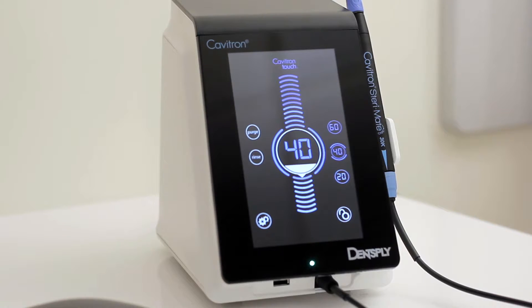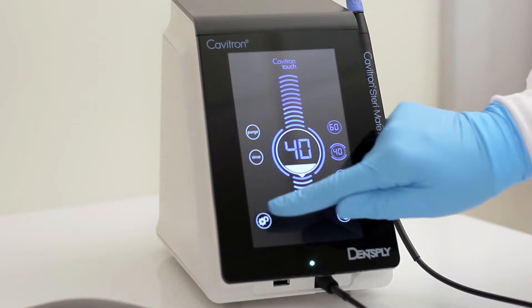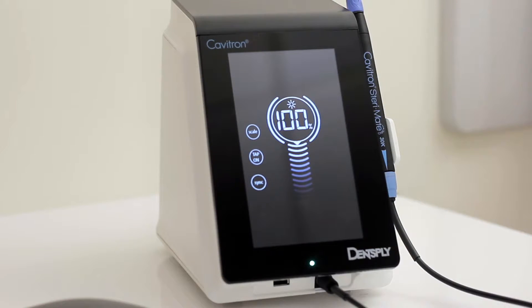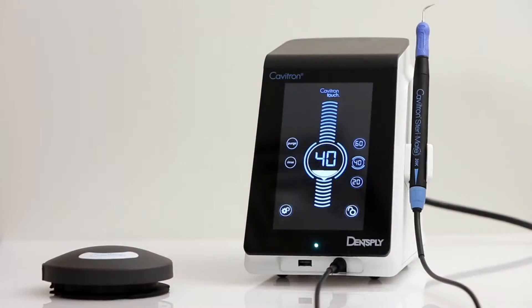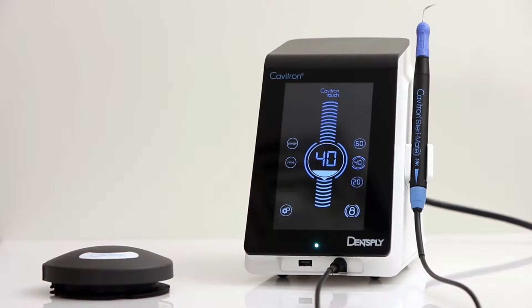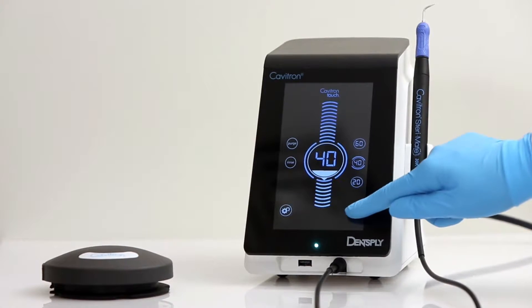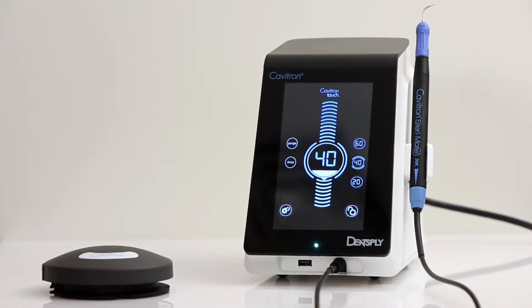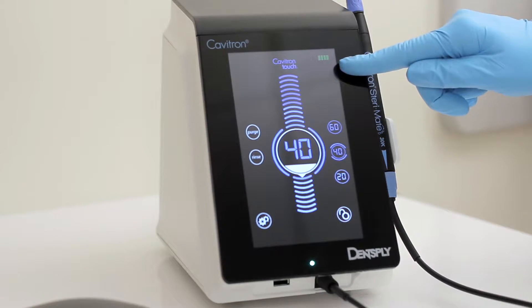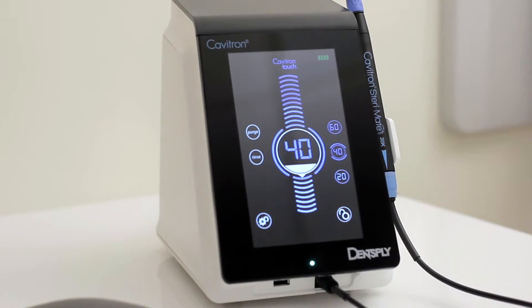To access the settings menu, press and hold the icon for 2 seconds. The lock icon is pressed and held for 2 seconds to lock the screen, disabling adjustment of any parameter until the icon is pressed and held for 2 seconds. The upper right corner displays the battery level of the foot pedal.